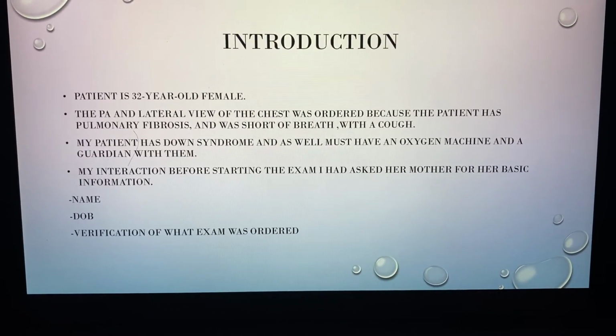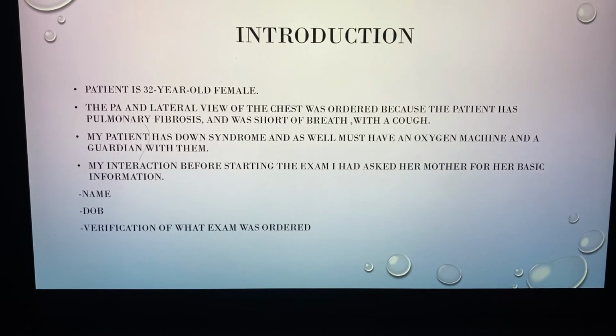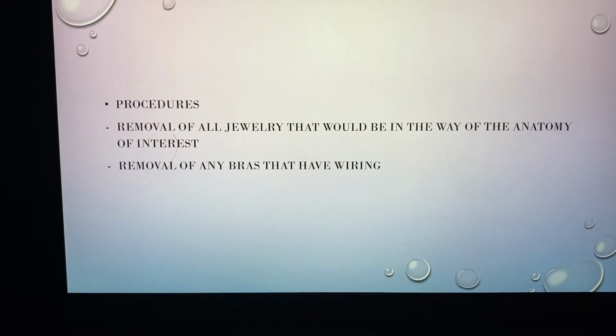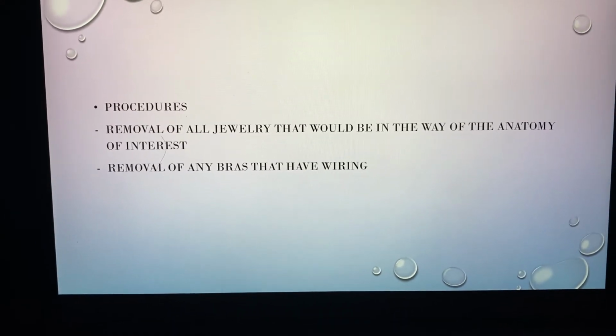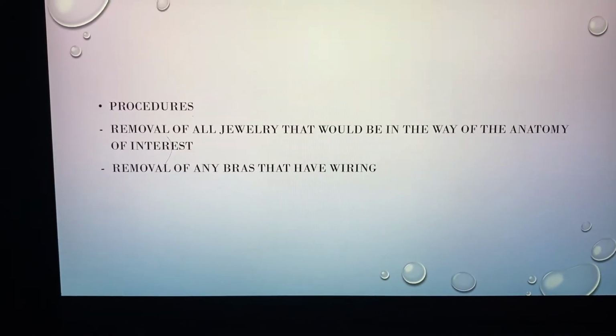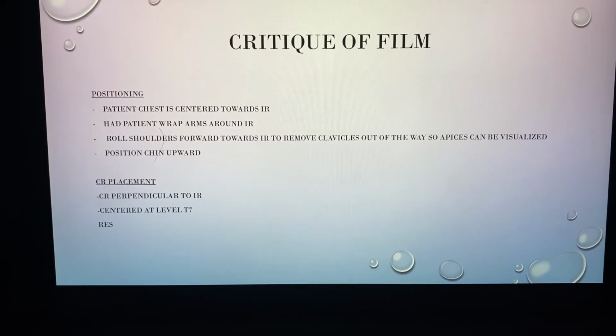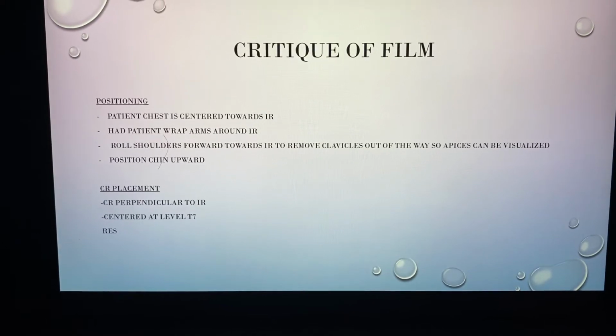My interaction before starting the exam: I asked the mother for the patient's information, her name, date of birth, and verification of what exam was ordered. The procedures had her remove all her jewelry that would be in the way of any anatomy, and also her bra.